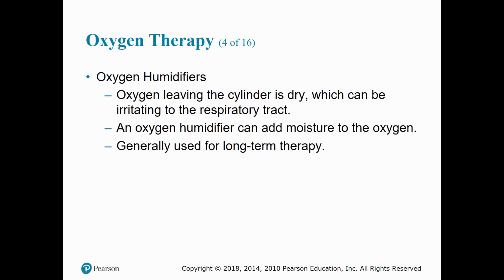Generally, we'll use humidifiers for long-term therapy. Now, as EMS providers, we generally don't do humidifying oxygen, just because of what it takes to hook up. However, you may come to a patient's house where they have an O2 humidifier, their oxygen hooked up into a humidifier for them to breathe through.